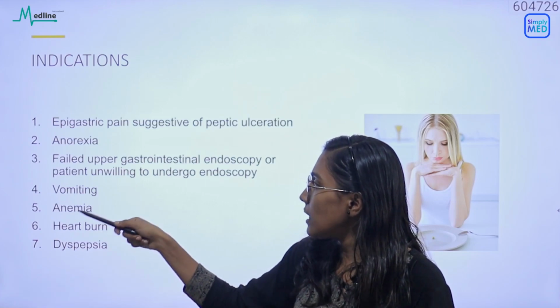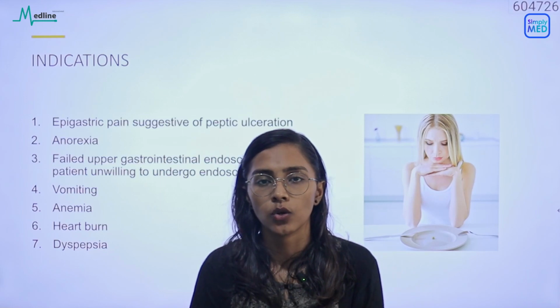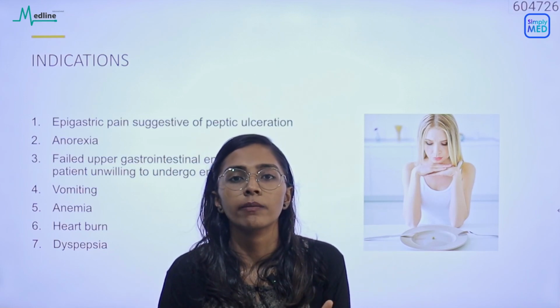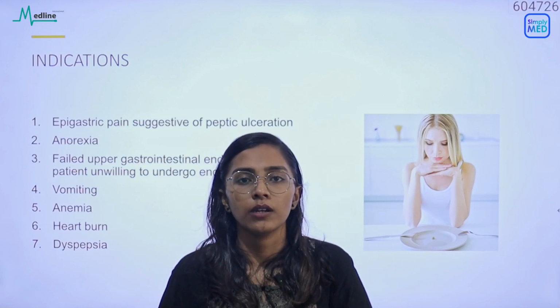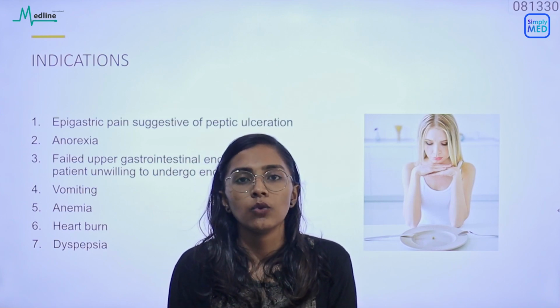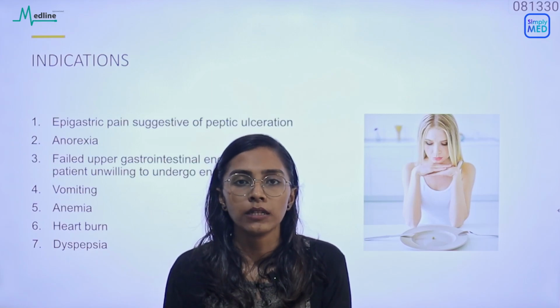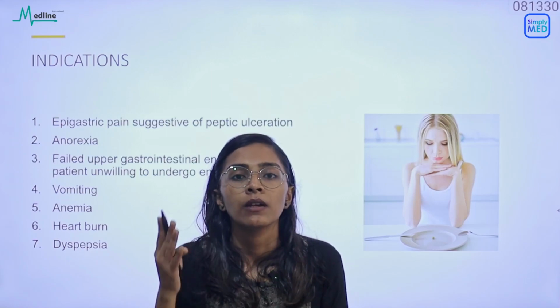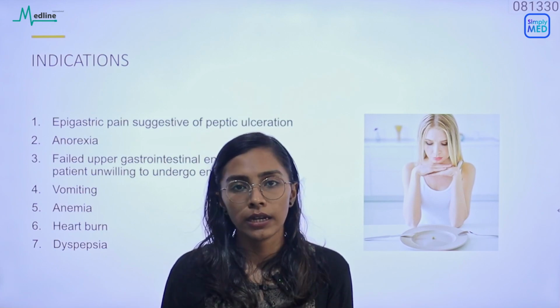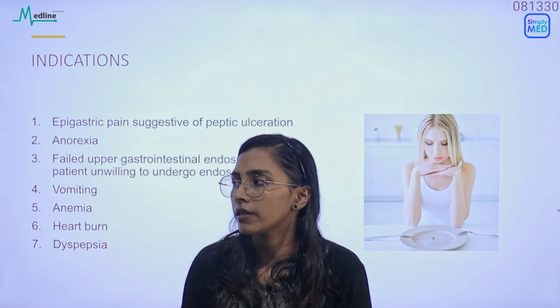And then we have failed upper gastrointestinal endoscopy, or the patient being unwilling to undergo endoscopy. In some patients they won't be comfortable with the endoscopy procedure. Or sometimes we won't be able to perform endoscopy in some patients. In that case barium meal is an alternative to endoscopy. So in such patients also we will do a barium meal study.